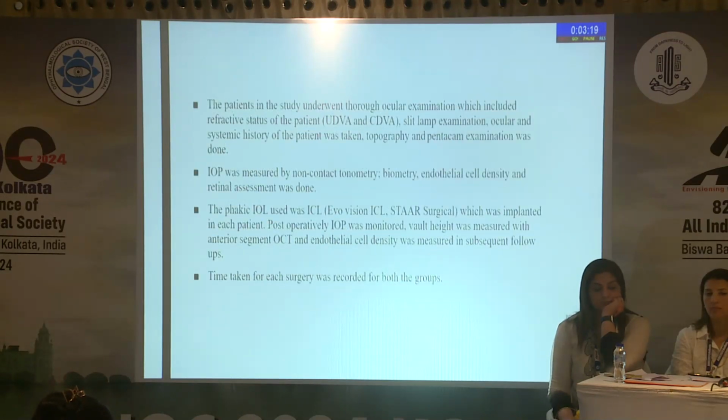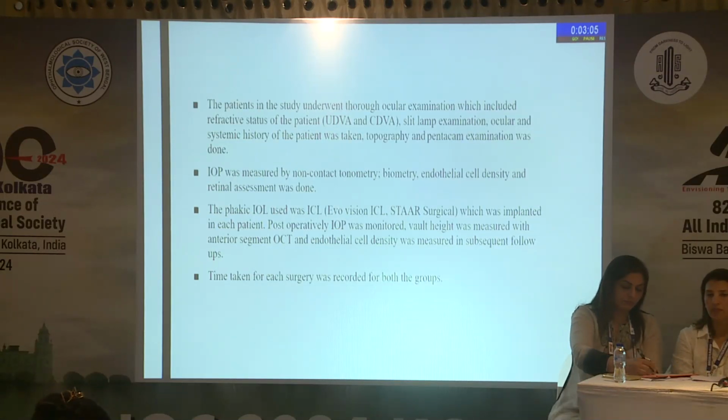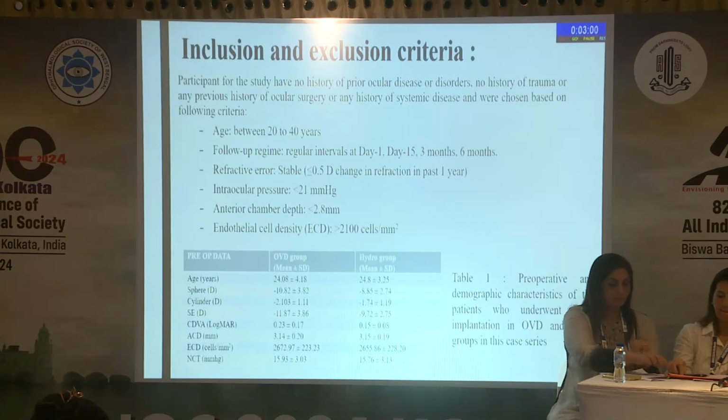Patients in the study underwent a thorough anterior and posterior segment examination, and the IOP was measured by non-contact tonometry, biometry was done, endothelial cell density was measured, and retinal assessment was done. The phakic IOL used was ICL, by STAAR Surgical. Time taken for the surgery was also recorded for both the groups.